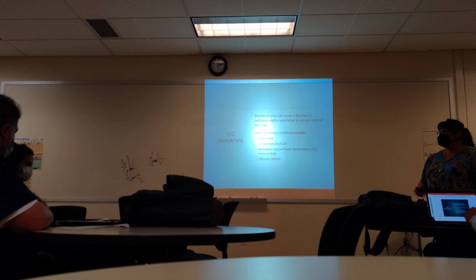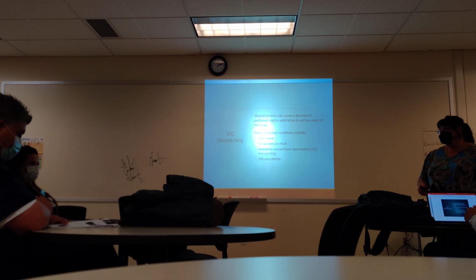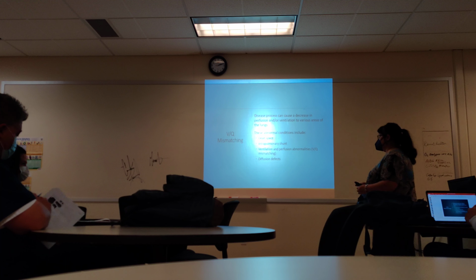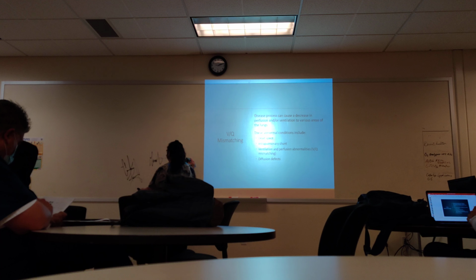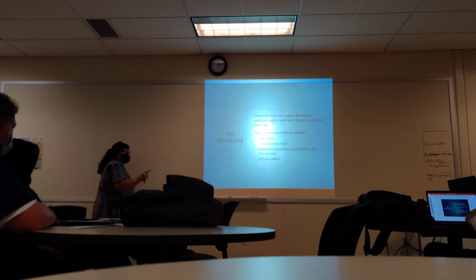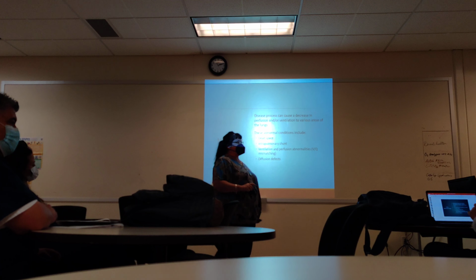And on your video, you were saying something about a board question on how to improve it, and it's always cut tubing? Remove dead space. A really good example would be something like this. One tiny link of this blue tubing here, just this much, that's 50 mLs of dead space added. That's a lot. Every piece of this that I have is a lot of dead space that I'm adding to the patient's circuit. So you're going to see questions like this on the boards.